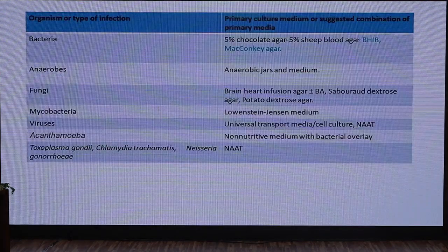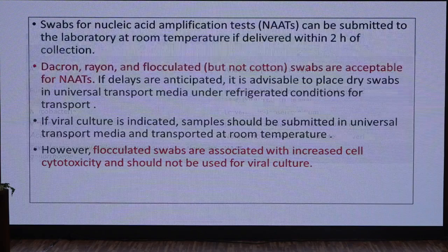Now, what is the difference between aerobic and anaerobic culture? For aerobic culture, you can send the sample to the lab. But if you are suspecting an anaerobe, you have to directly put the sample into the anaerobic media, and then send it to the lab. Rather than just sending a simple sample, we will not be able to grow anything on that. Next is for NAATs.